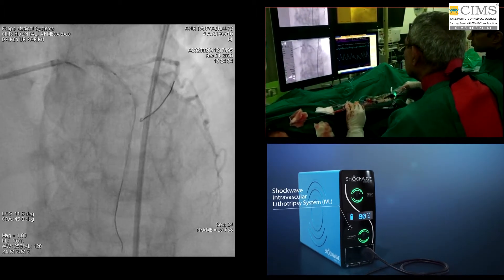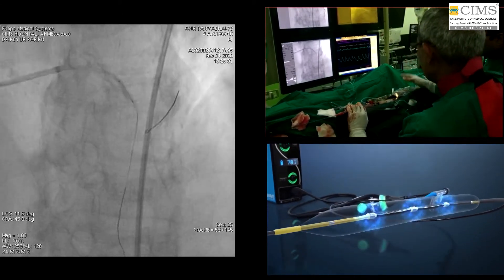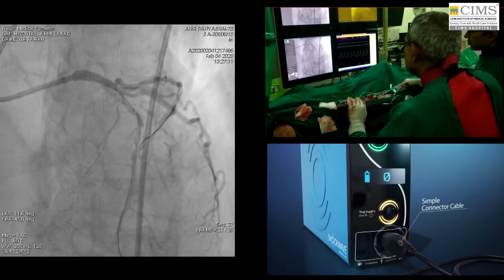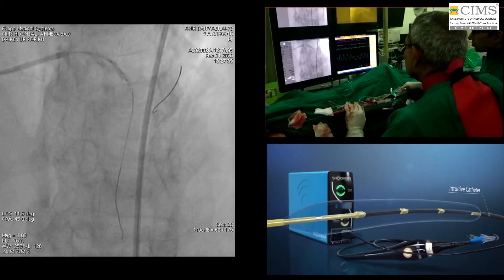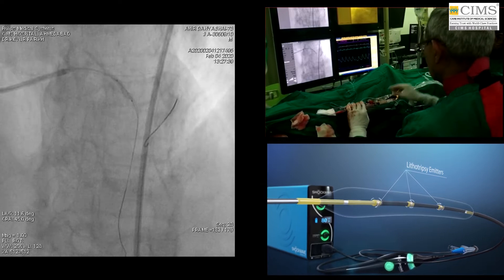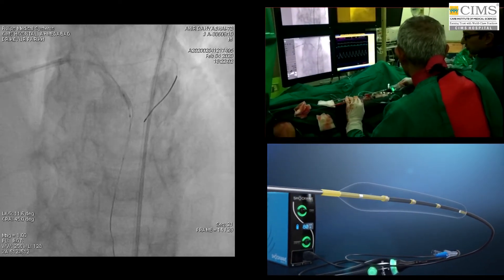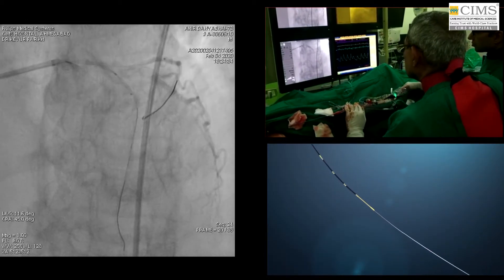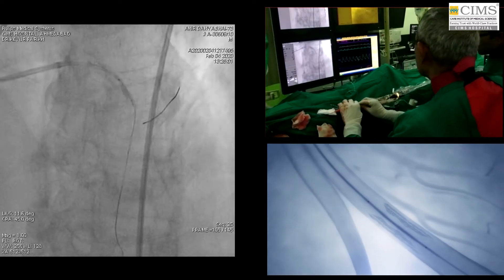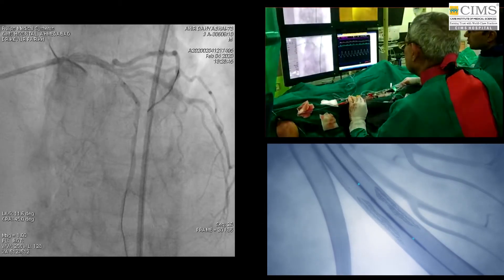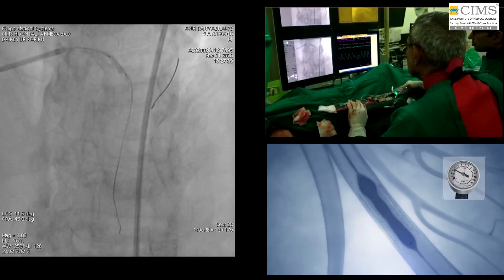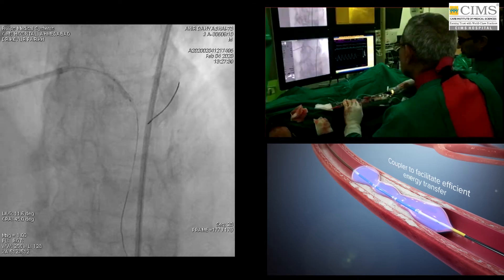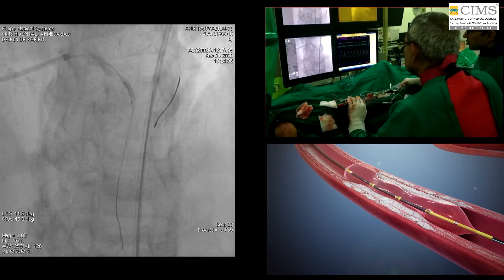The Shockwave intravascular lithotripsy system creates pulsatile sonic pressure waves to modify calcium in a safe manner. It consists of a compact rechargeable generator, a simple connector cable, and an intuitive catheter housing an array of lithotripsy emitters enclosed in an integrated balloon. Through localized delivery of lithotripsy, the IVL system minimizes trauma, optimizes outcomes, and simplifies procedures. The IVL catheter is advanced and placed at the lesion using marker bands under angiography. With the integrated balloon expanded to sub-nominal pressure of 4 atmospheres by a mixed saline and contrast solution, the fluid within the fully opposed balloon acts as a coupler to facilitate efficient energy transfer of the sonic pressure waves into the vessel wall to reach the calcium.